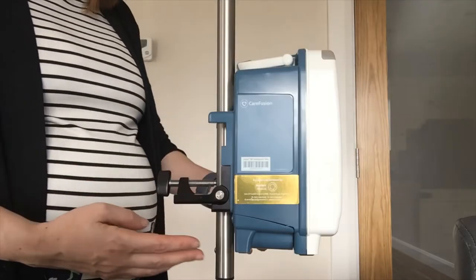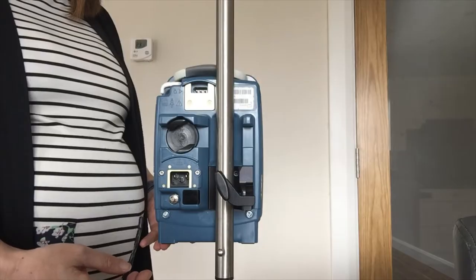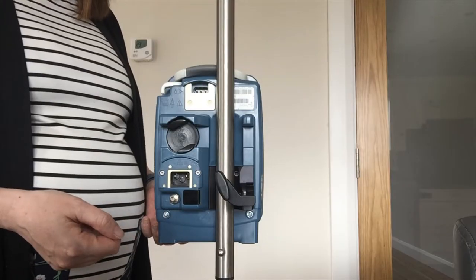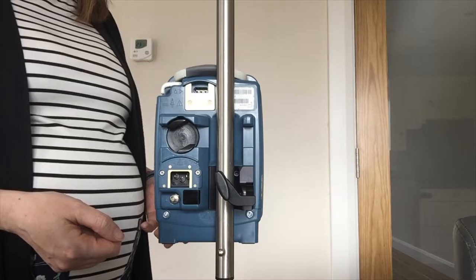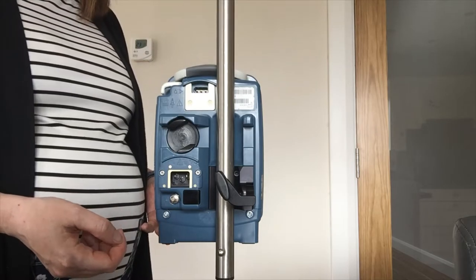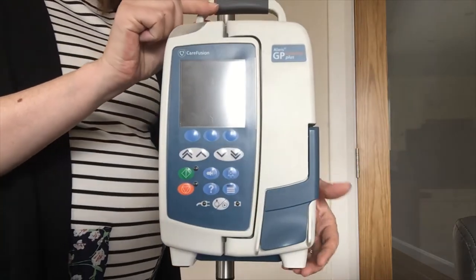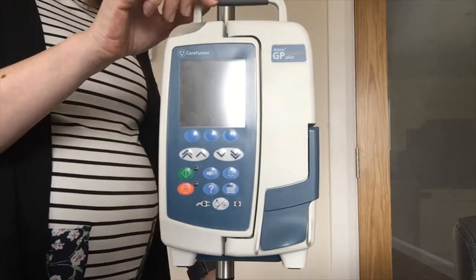This pump attaches onto your IV stand using the integrated pole clamp. You've also got your socket for charging. Best practice is having your pump charged at all times, but it has a battery backup of 6 hours running at 25 ml per hour. This pump also has an integrated handle on top so if you need to carry or transfer your pump you can use that.